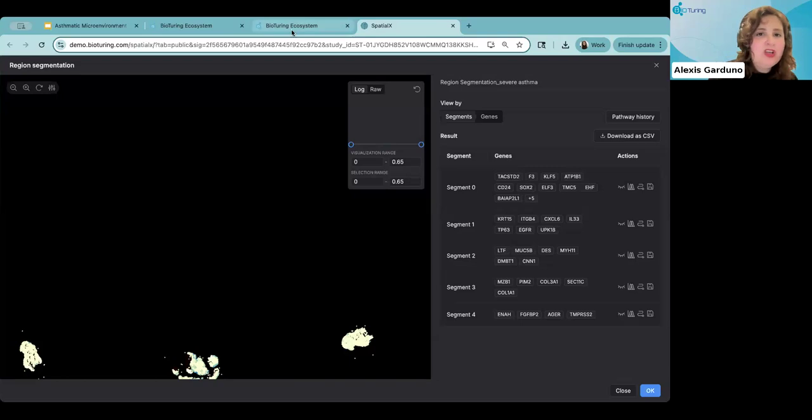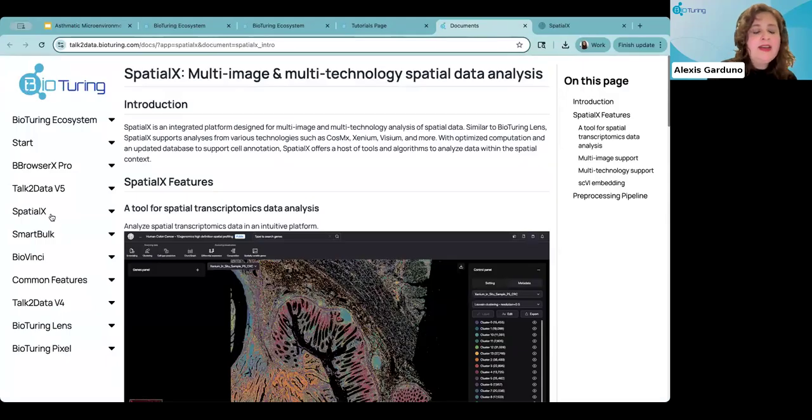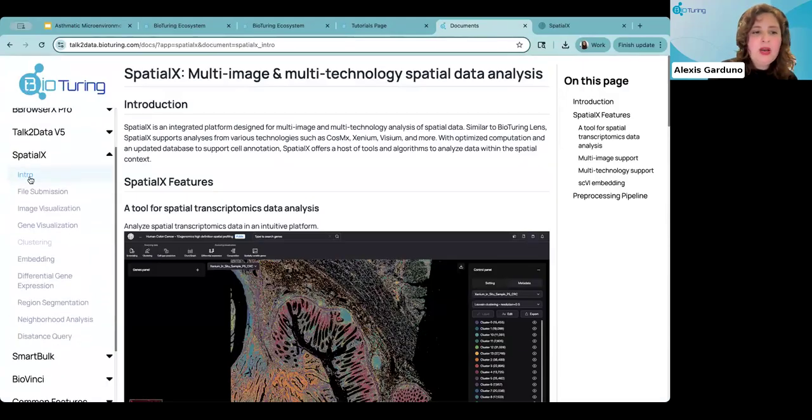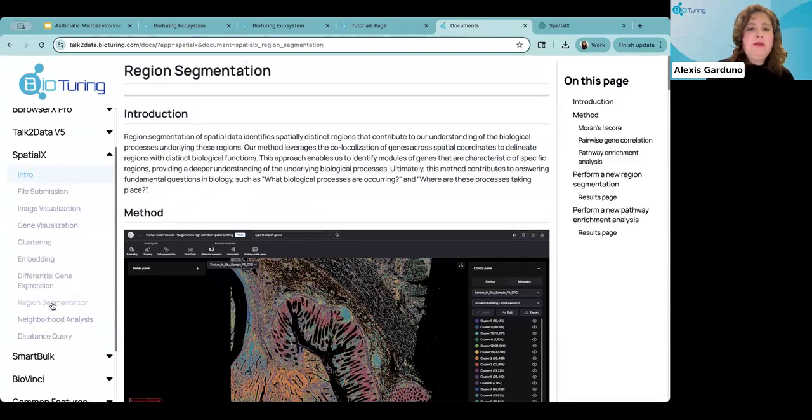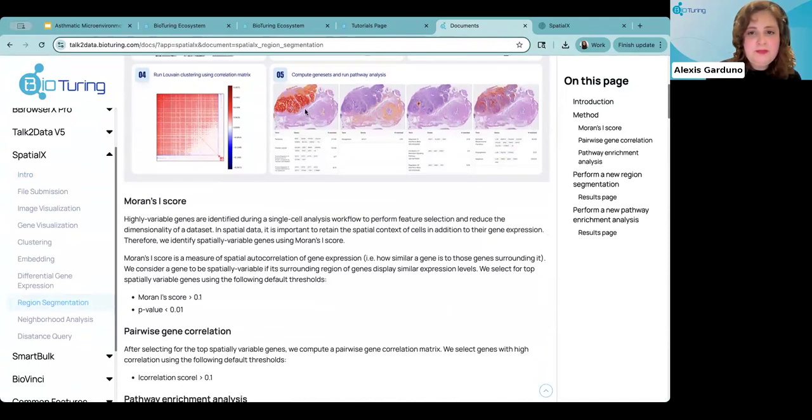If you do have any questions and you want to understand those features a bit more, what you can do is go into the tutorial, into our documentation, and go through it. We actually go a bit deeper into the functionalities themselves and how we calculate that information in the system.